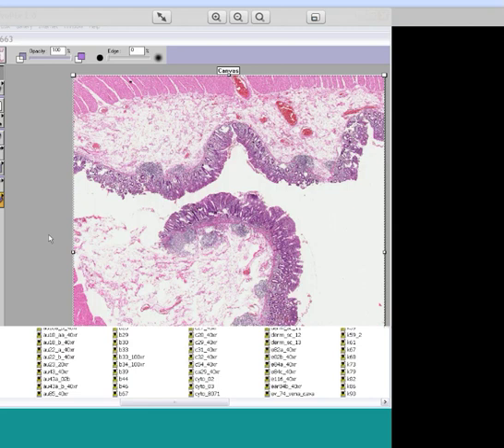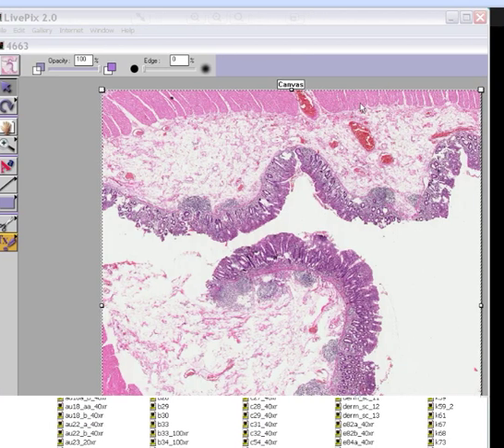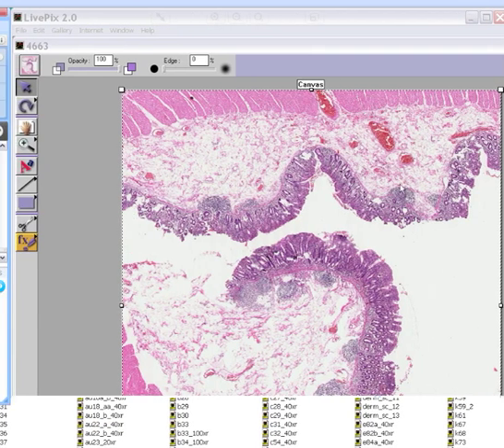Okay, let's see if Lois can see it now. Okay, good. You're seeing a slide, and I think what you could see, at least from this power, is that it's a GI tract organ. And you could see a band of smooth muscle on the top. And you could see that there's a lot of loose submucosal, soft, loose, vascular connective tissue between the muscularis and the mucosa.